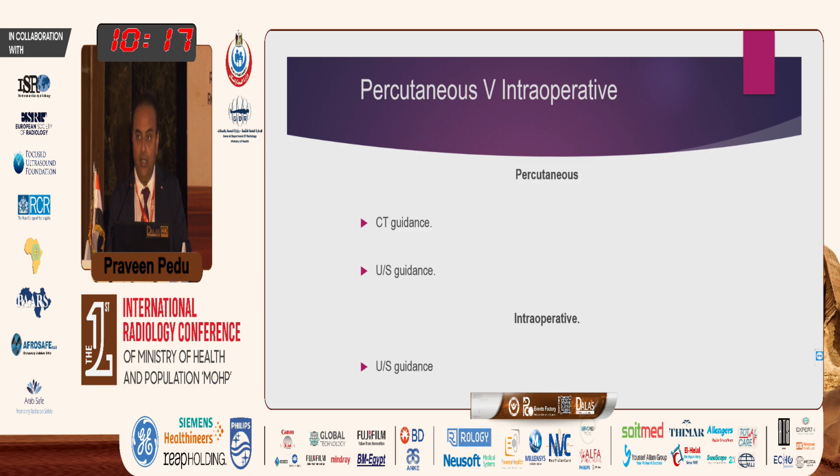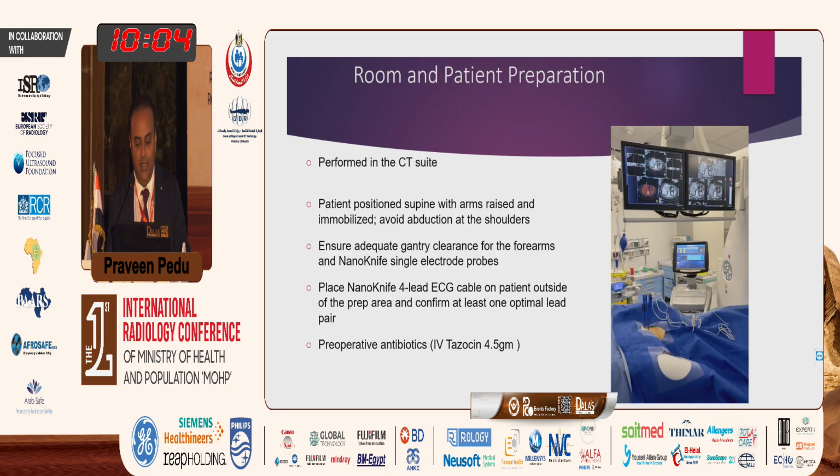IRE can be done both percutaneously and intraoperatively. It can be done with CT guidance or ultrasound guidance when you're doing it percutaneously. But if you're using it as an intraoperative procedure, you have to use, obviously, ultrasound guidance. The setup for IRE is similar to a microwave. So often what you need is a CT which has CT fluoro ability, so you can place these multiple needles, and you have to have the ability to reconstruct the needle placement in multiple planes, so that you know those needles are nice and parallel to each other, and they're nicely bracketing the tumor in order to make sure that you treat the tumor effectively.